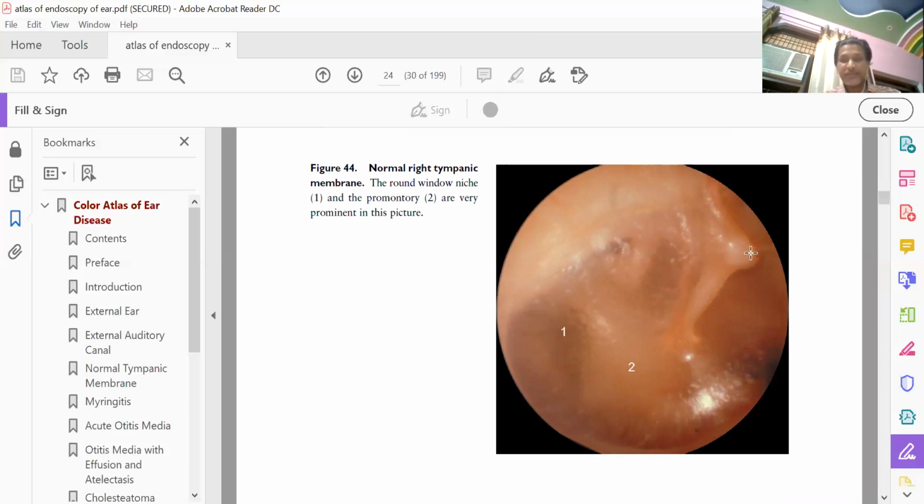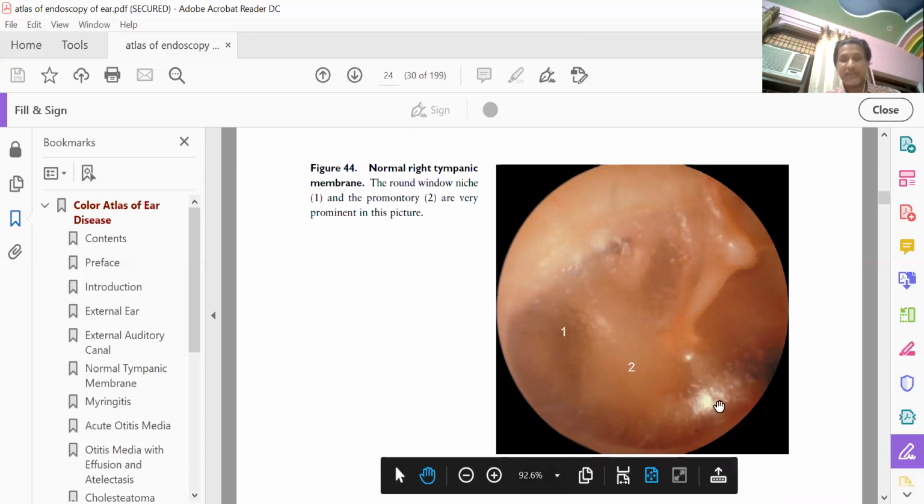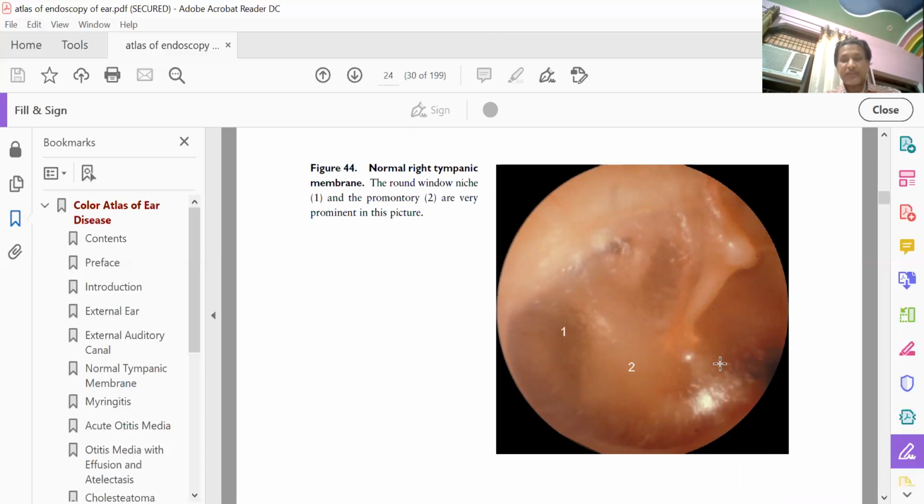It is always covered with a cartilaginous cap, present between the tympanic membrane and the lateral part of the handle of the malleus. You can also appreciate the cone of light. The cone of light is the focusing of the light thrown through the canal, and it settles down into the anterior inferior quadrant to give an impression of a cone of light.